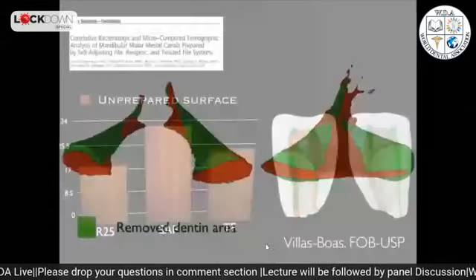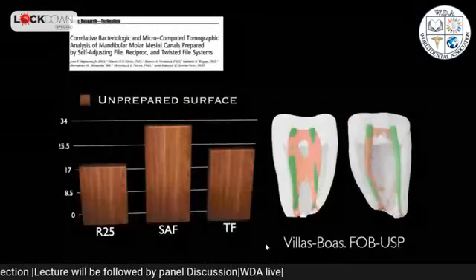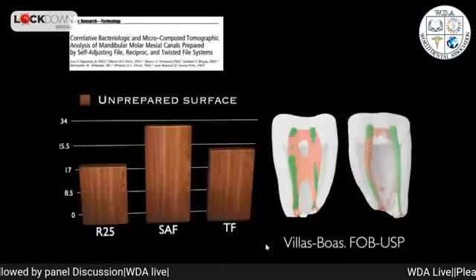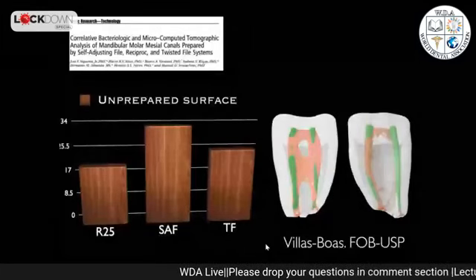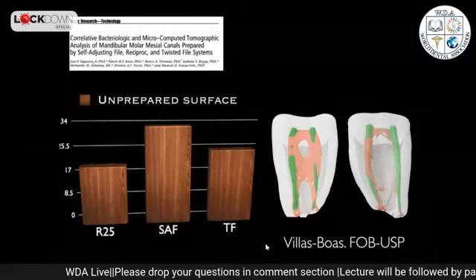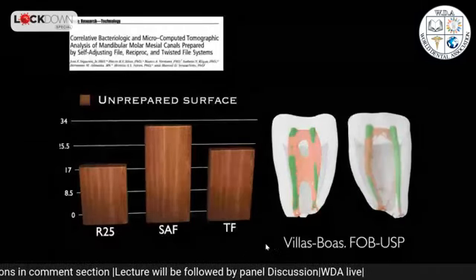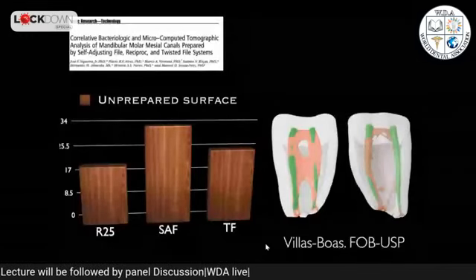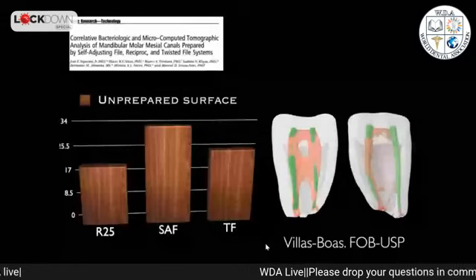And this was proved by Dr. José Siqueira from Brazil. He has been performing several experiments trying to see the cleaning ability of different NiTi instruments. Basically, we always found, or he always found, that it is almost impossible to clean mechanically completely the root canal space.